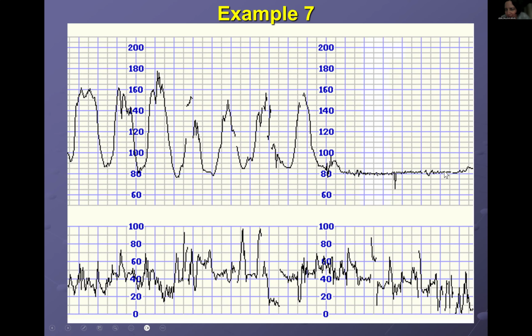Now, to be honest, this is probably the point where you were called in. But in reality, maybe you should have been called in well before, because although here it's obvious this is bradycardia, in the 10 minutes before and even the 15 minutes before, already there were signs showing you that there is a problem. Why? First of all, looking at the contractions, you can't really say what's happening. It seems to me that there is no relaxation between contractions. So there is an increased tone. You can't really tell what's happening. So that doesn't look good.